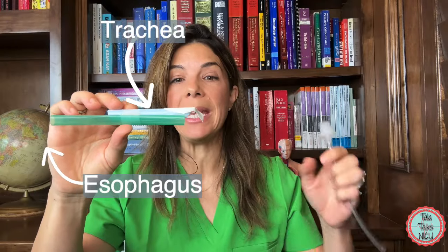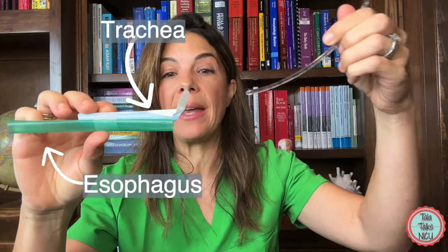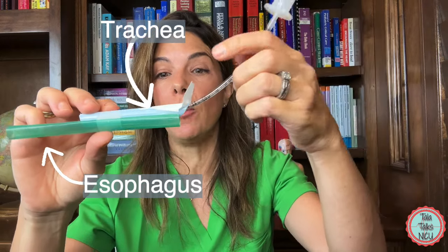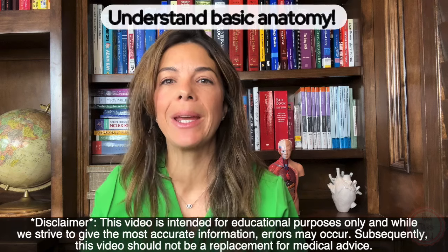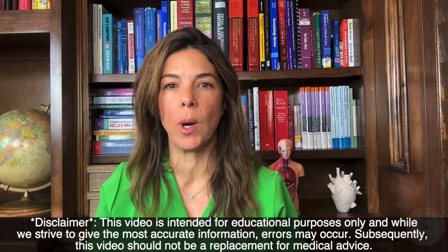The trick is we need to get that epiglottis out of the way so that we can then thread the endotracheal tube down into the trachea. Before we go over some great tips on how to intubate babies, I want to go over some basic anatomy so you understand what we're actually trying to do when we intubate.